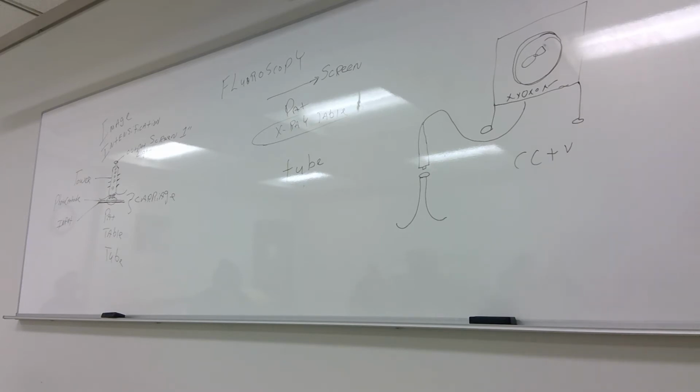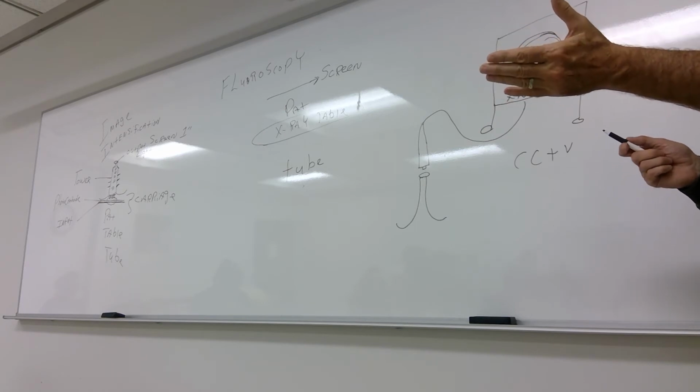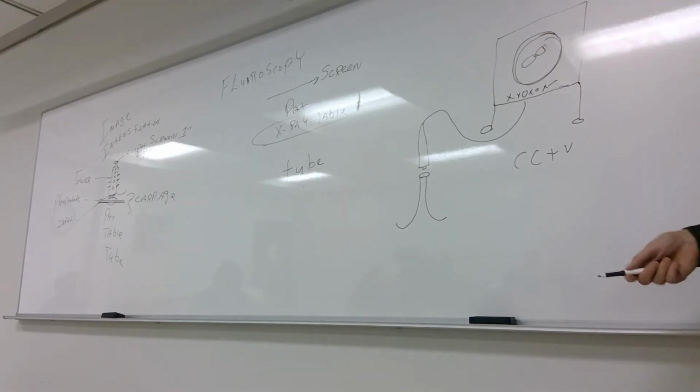So now, this room doesn't have to be dark. You can use your cone vision. The patient isn't so anxious because it's a lighted room. If you wanted to do some things in the room, you have light, and you can do it, like the myelogram. There are procedures on the myelogram that you need to do, but not in a dark room. You can do them in a lighted room. So there are so many advantages of this.